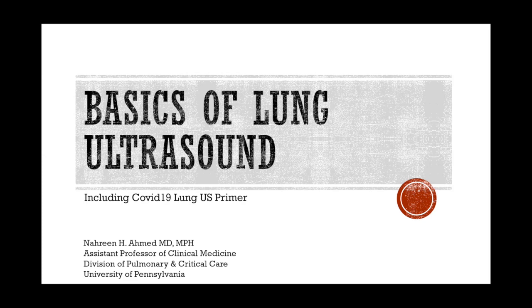This is a webinar to learn more about the basics of lung ultrasound.